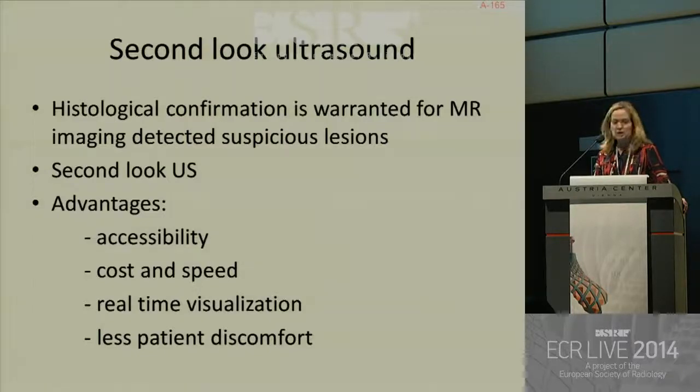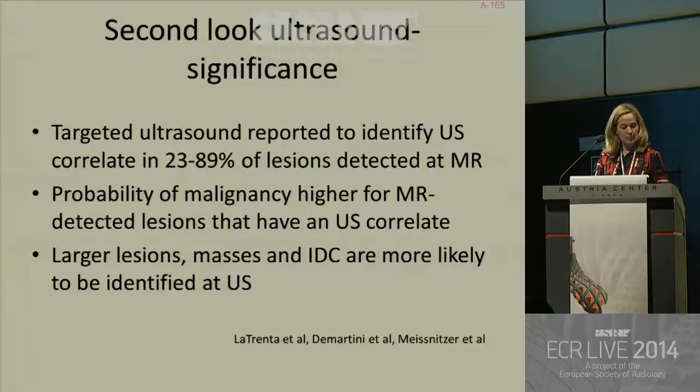And the advantage of doing a biopsy under ultrasound over MR is obviously its accessibility. It's less costly and faster to do. And it's performed with real-time visualization. You can see your needle going through the lesion, and there's less patient discomfort.